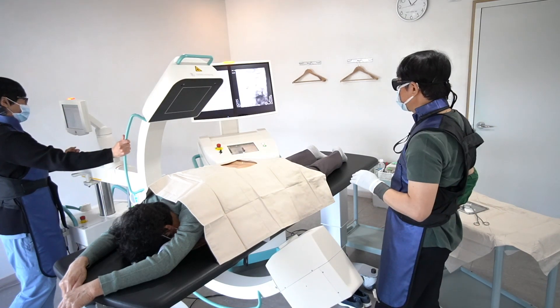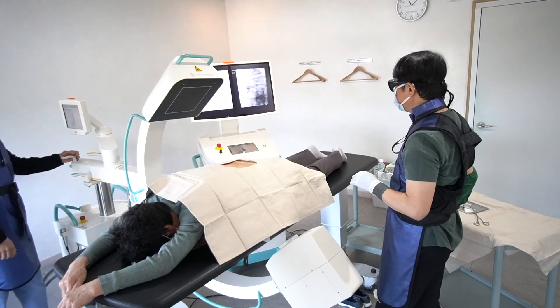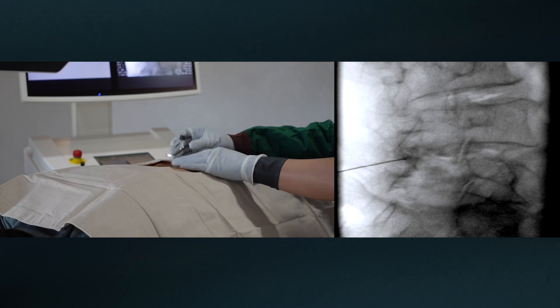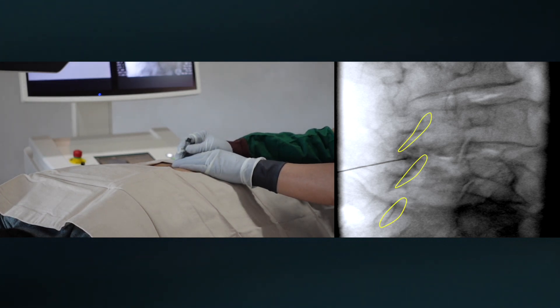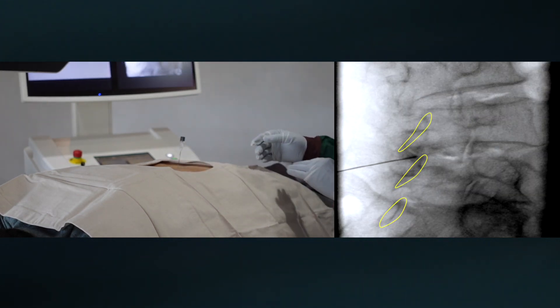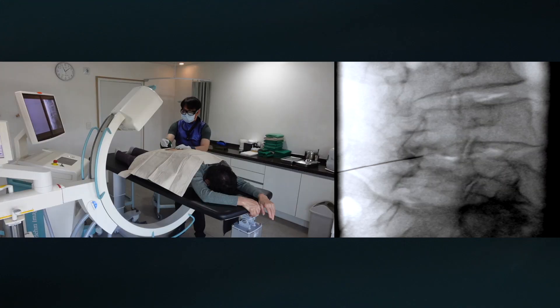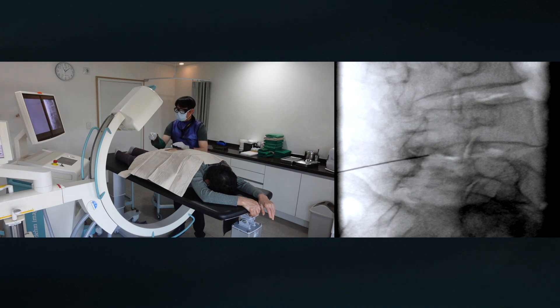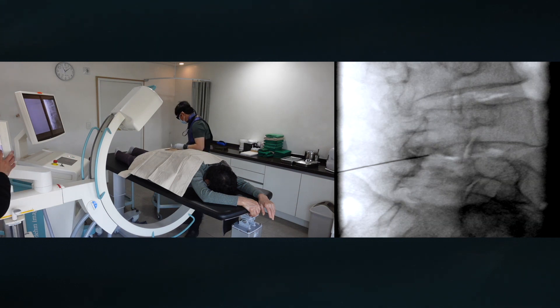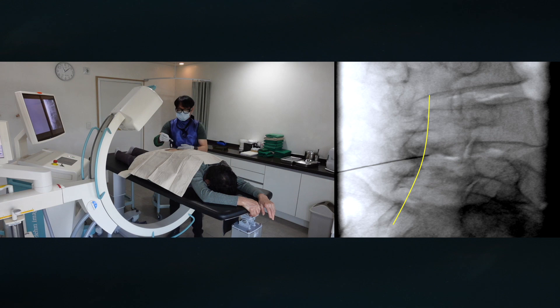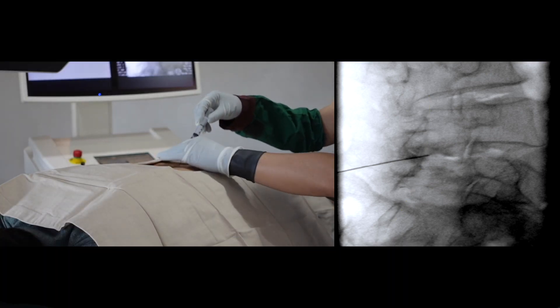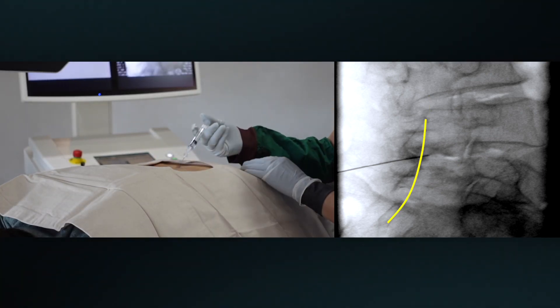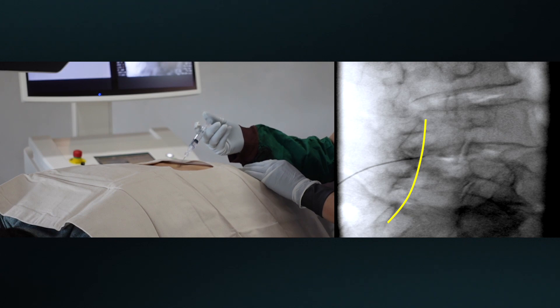How much do I rotate the C-arm? I turn the C-arm as much as possible until I can see the clear profile of the lamina's cut section. I'll insert the needle until overpassing the yellow line. My needle has now passed the yellow line.